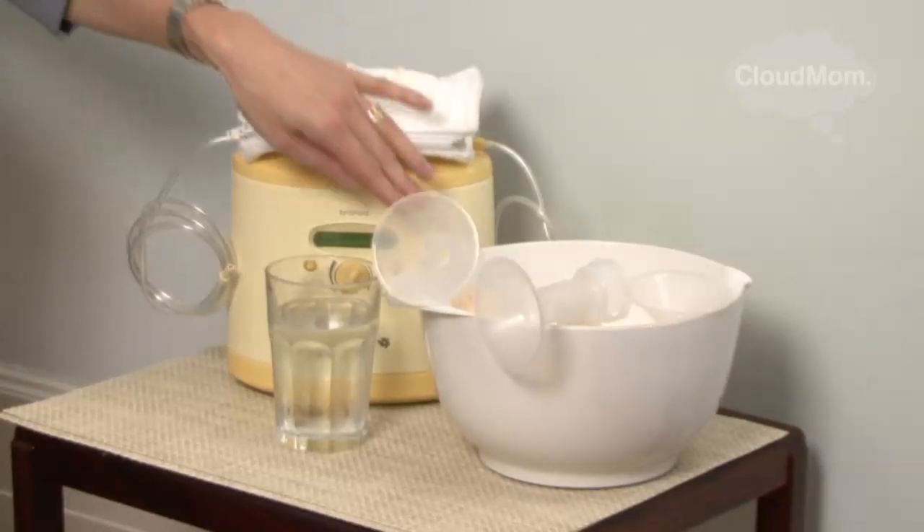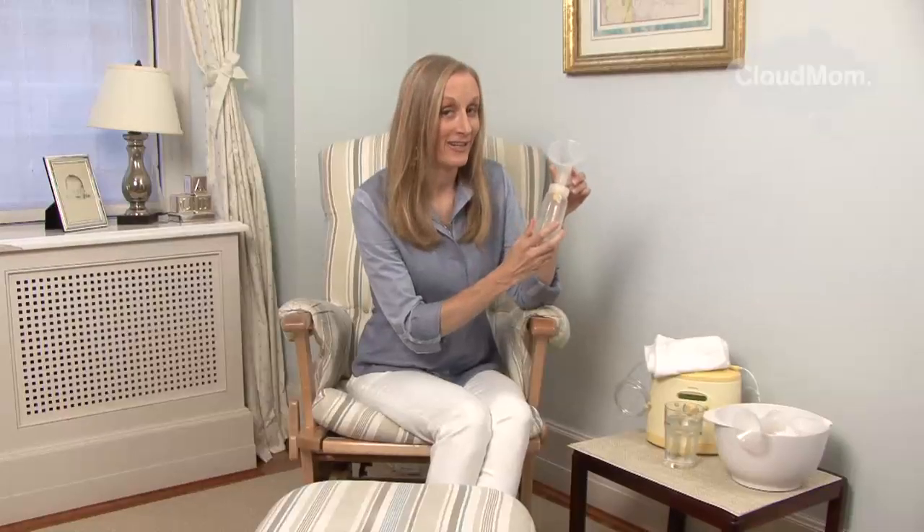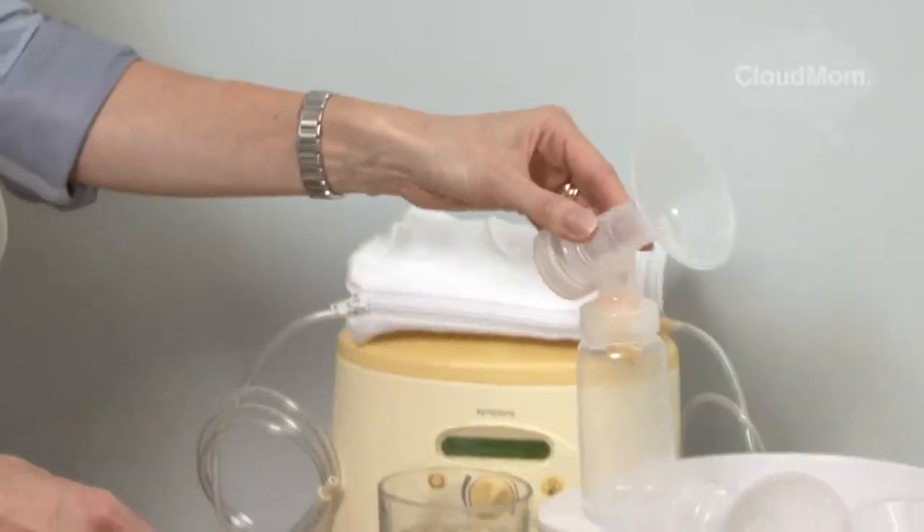Then I would get a round plastic bowl. In this bowl you can put, ready to go, your bottles onto which you've screwed the breast shields. So you leave these all ready to go and clean in your little bowl.